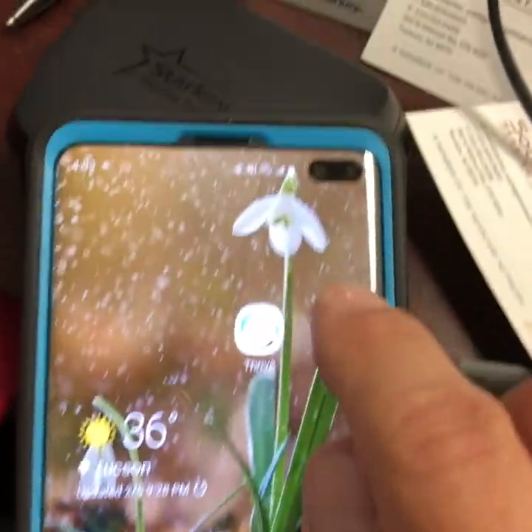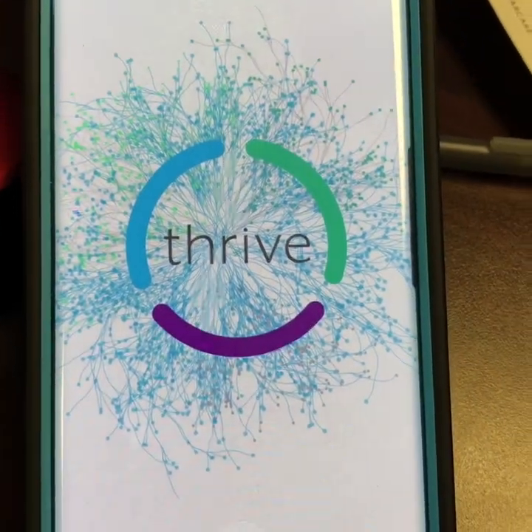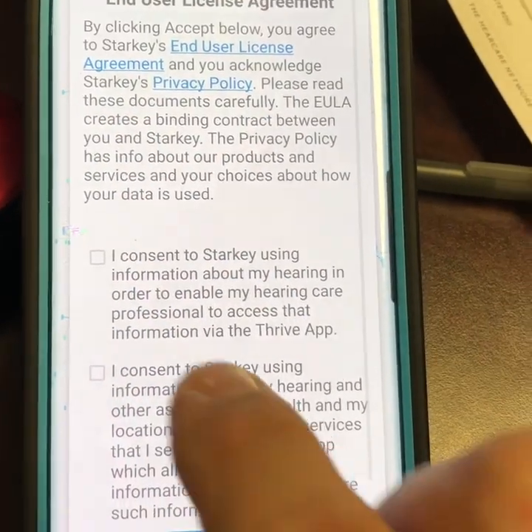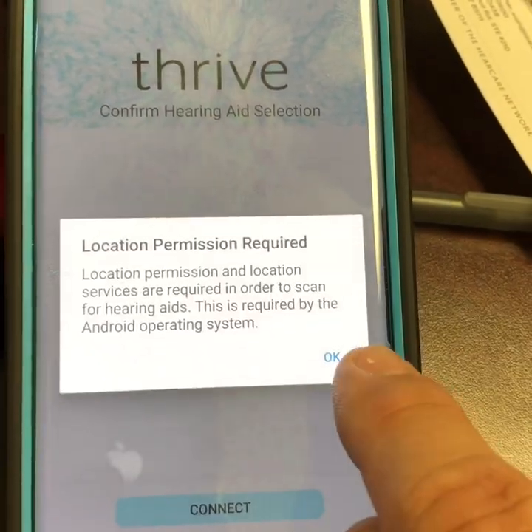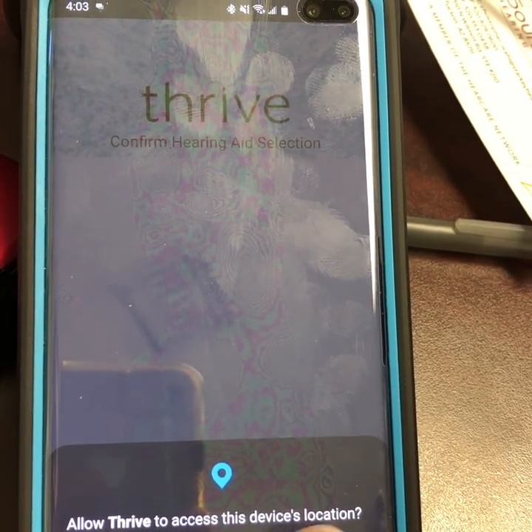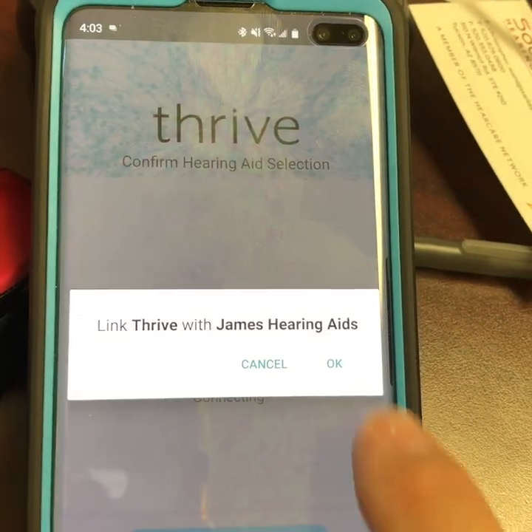And you can stream. Go ahead and open up the app for your hearing aid. In this case it would be the Thrive app — Starkey Livio AI-2400 hearing aids. Agree to the terms and allow permission for location. Select the hearing aids and connect.